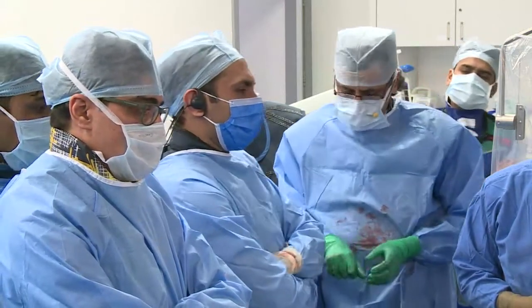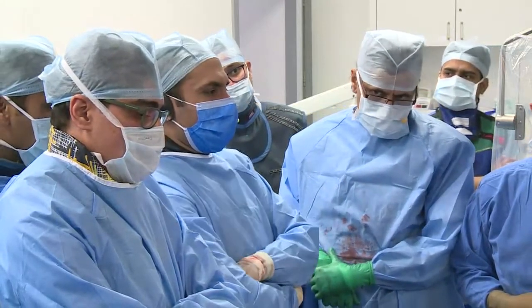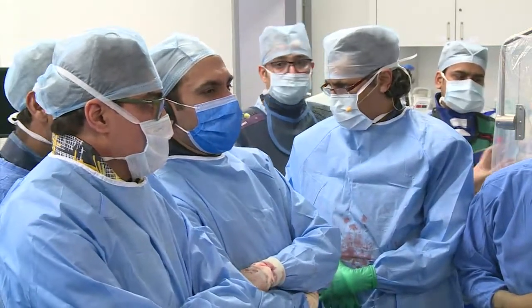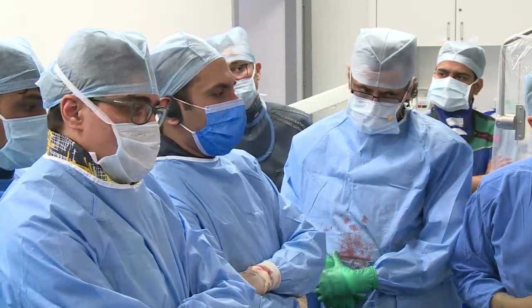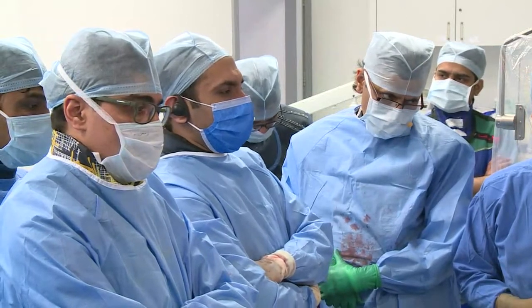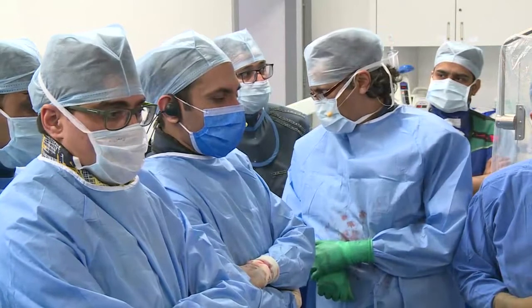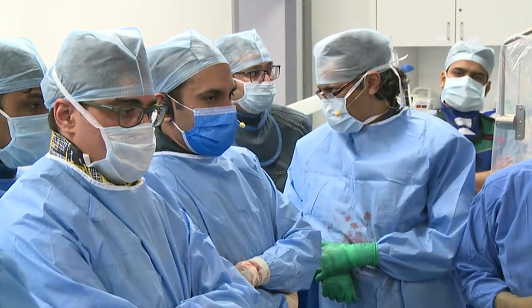In the past when we were using a non-balloon pacemaker, everybody must have experienced inferior wall MIs: you put a pacemaker, you are happy, and on the third day when you remove the pacemaker, they develop tamponade. So yes, we don't see any perforations with balloon tip. I think that is the main utility of this pacemaker, to decrease the RV perforations. And your experience is that it's stable enough for 100% capturing?